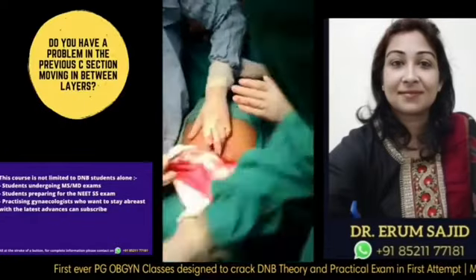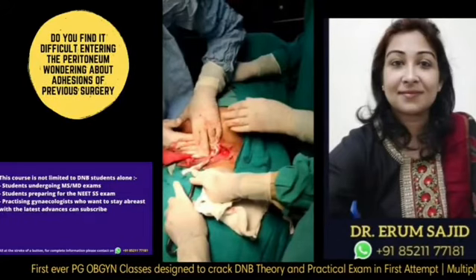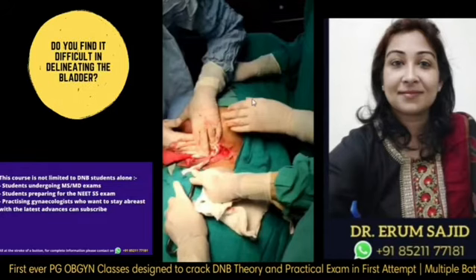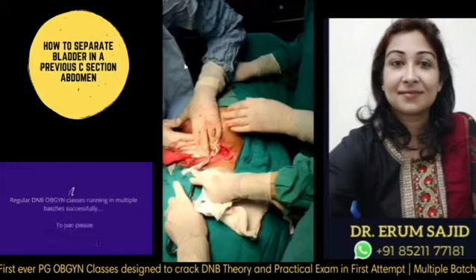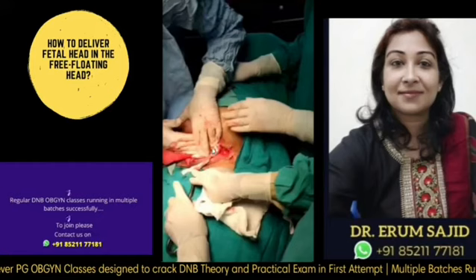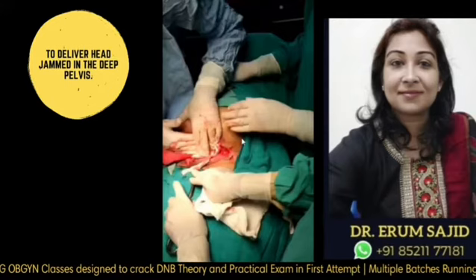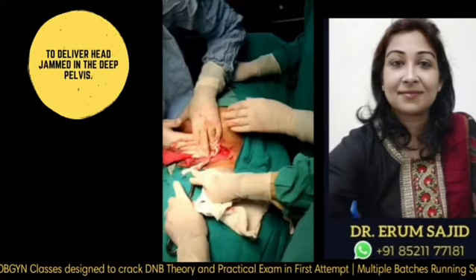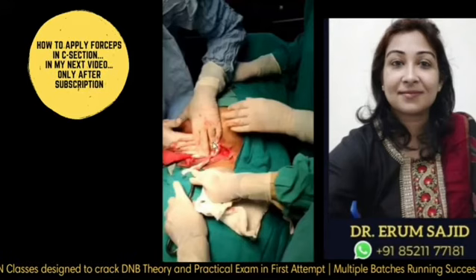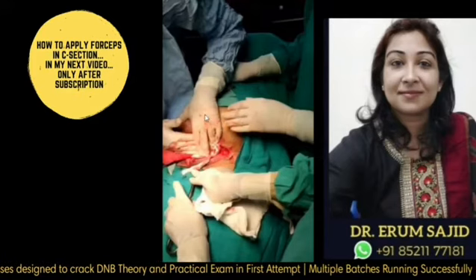So I do this, and now look at this movement. This movement is called putting the uterus back, rotating the uterus, fixing the uterus. Uterus is usually dextro-rotated, you know that, right? So if I do not correct this dextro-rotation, I might give an incision at the wrong place and it will extend to most probably the left angle. The uterine artery might get torn. So I have to correct the uterine position, put it in the right place, ask the assistant to stabilize the uterus. It should not come back now. Once she holds it, it should not come back now.